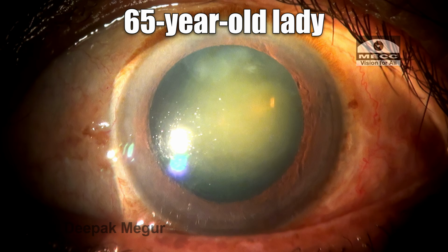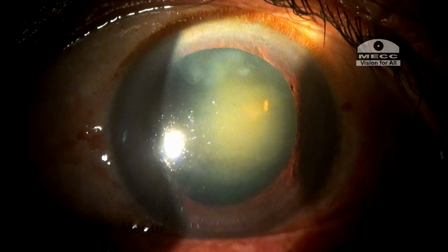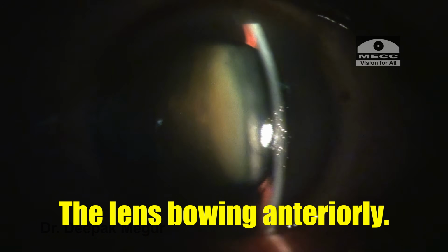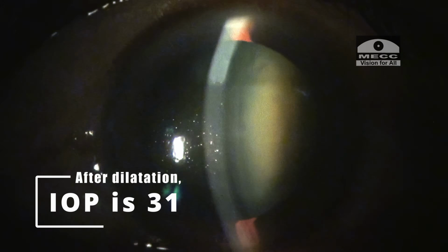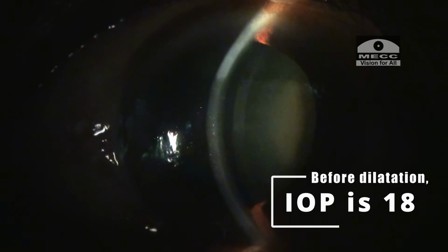A 65-year-old lady is posted for cataract surgery, and on the day of the surgery, once the pupil is dilated, I'm seeing this case, and there is one striking feature which has caught my attention, that is, the chamber is extremely shallow. The lens appears as if it is bowing anteriorly. The peripheral anterior chamber is very shallow, the iridocorneal touch is there, and the pressure which was checked after dilatation was in the early 30s. Before dilatation, the IOP was 18.